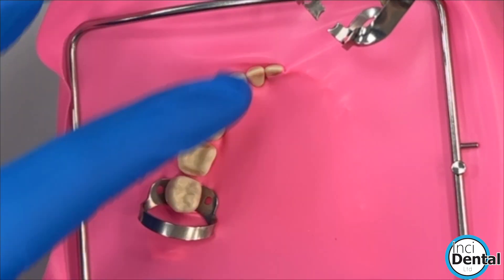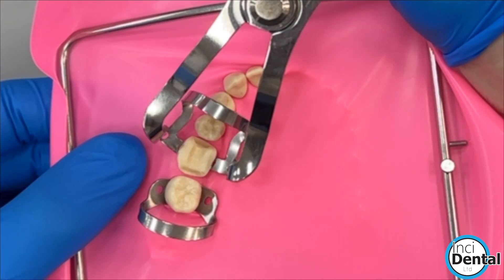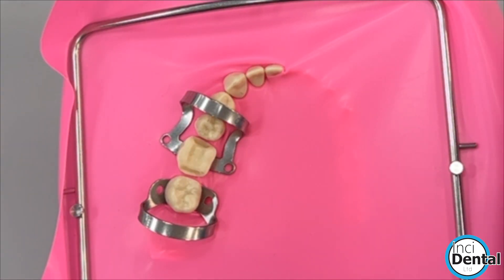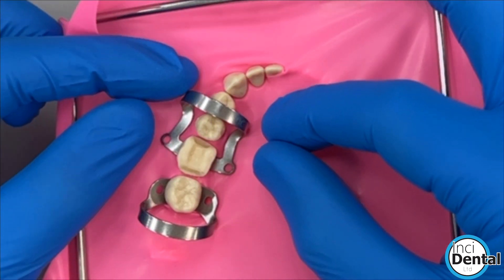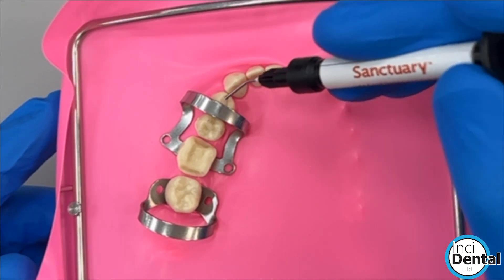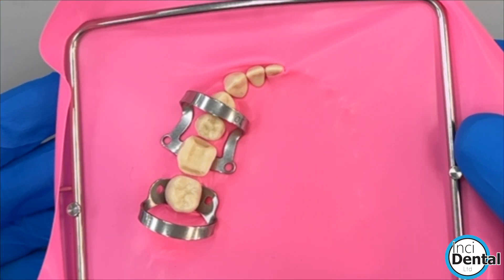You put your dam on and you might find it's riding up on the overlay preparation. What you can then do is open up your accessory clamp, place it on, and snuggle it down the tooth if needed. The OC clamp is very secure because of those angled tines, but if needed you could add some liquid resin without etching and bonding just to hold and secure it. You can also just press down a little to make sure it's really secure.